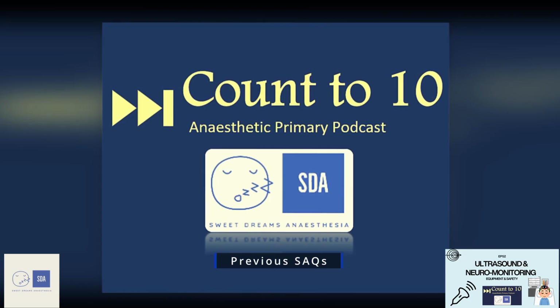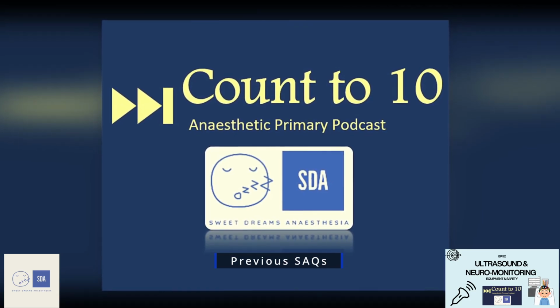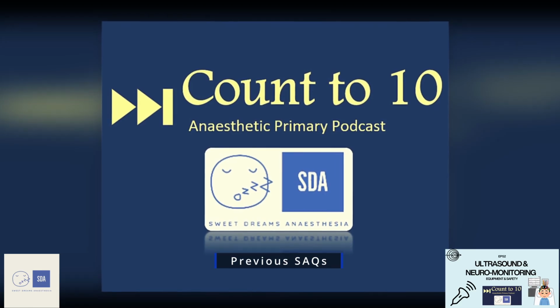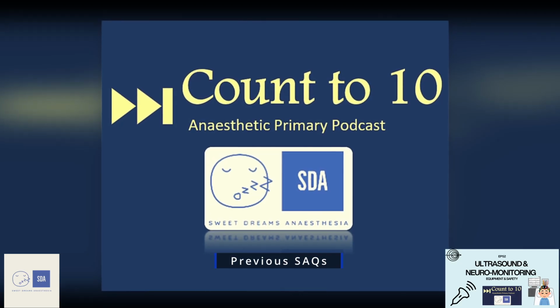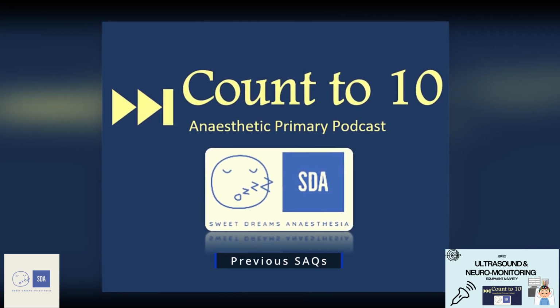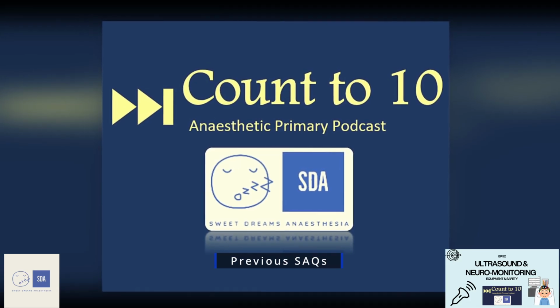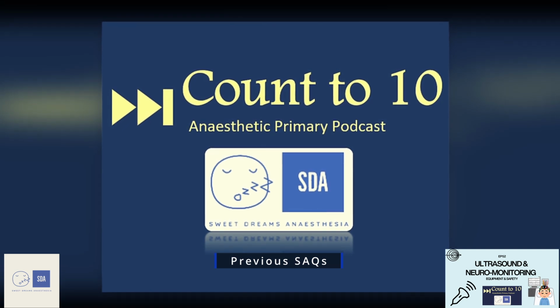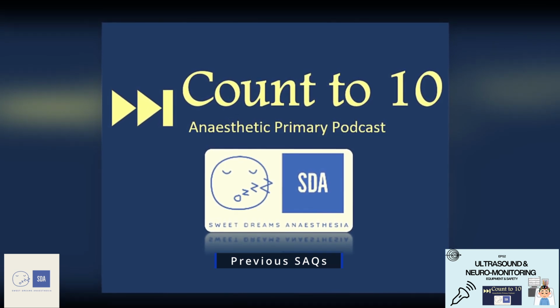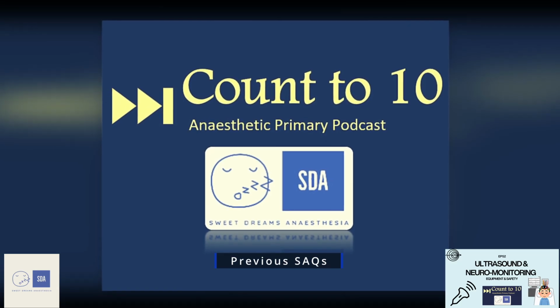Then my next heading would be image quality generation. This is divided into two characteristics. First, the characteristic of the sound wave, and second, the degree of reflection. With regards to the characteristic of the sound wave, the two characteristics we spoke about were the time taken for the sound wave image to return to the probe and the strength of that sound wave returning to the probe. These two characteristics determine the image location and the echogenicity of the image that is being scanned, and that's what we see in our classic B mode.